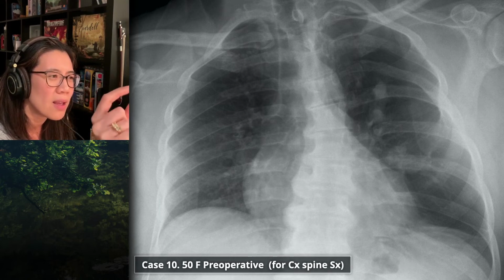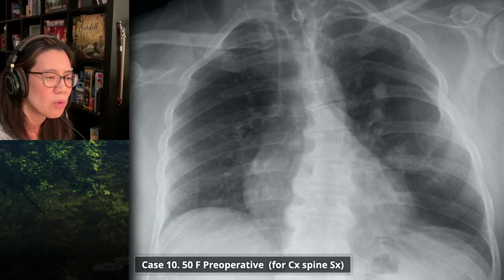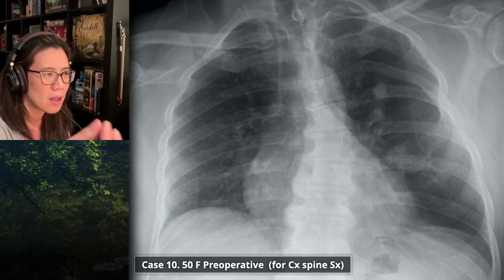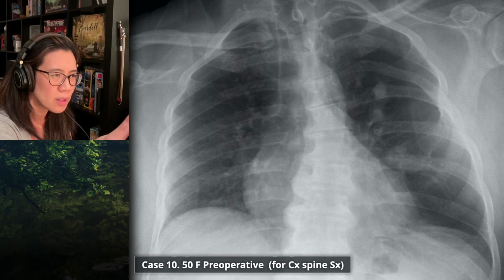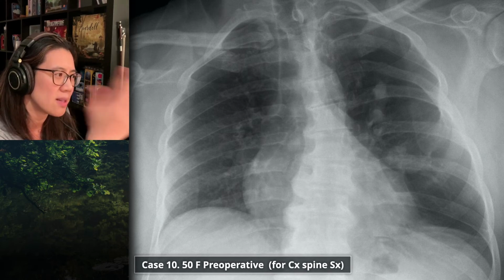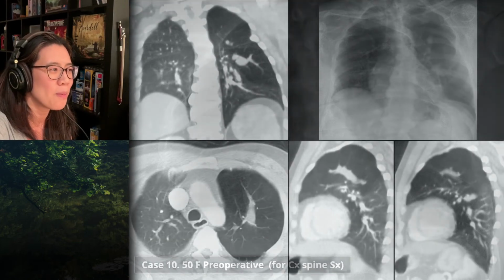And so then are you getting a bronchial type obstruction, which results in vasoconstriction of the periphery of the lung? Is that why you're getting that asymmetry? So definitely there is a paucity of lung markings, and I think the peripheral vessels are quite definitely hypoplastic compared to, I'm trying to find the right terminology here, but they're not as well seen as on the right side. So I do think there's an abnormality. Yeah, look at the next image. Oh, put me out of my misery.